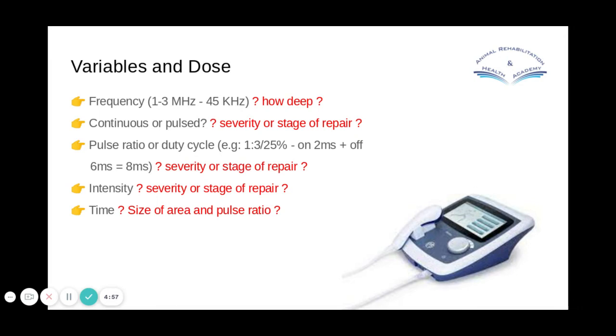But that's not to say that this 45 kilohertz frequency doesn't exist, and I know some of you may have a long-wave ultrasound machine. They are out there and they are being used. The effects, if you like, are very similar. It's just the frequency that's different.